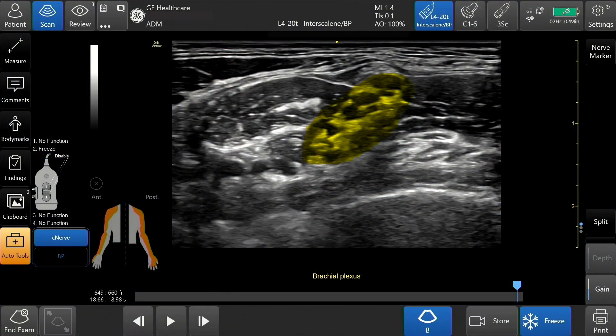C-Nerve is a machine learning-enabled tool intended to facilitate the detection and tracking of nerves during the scouting phase of a nerve block procedure. C-Nerve should be used prior to inserting the needle to inject the anesthetic agent. The C-Nerve tool is available for the following nerve scouting procedures.